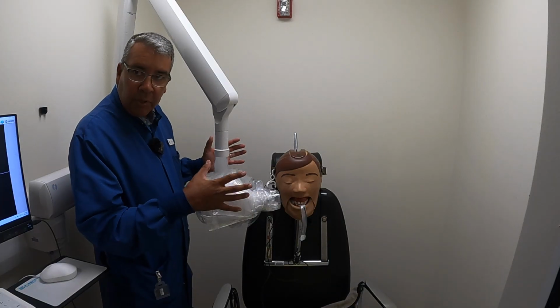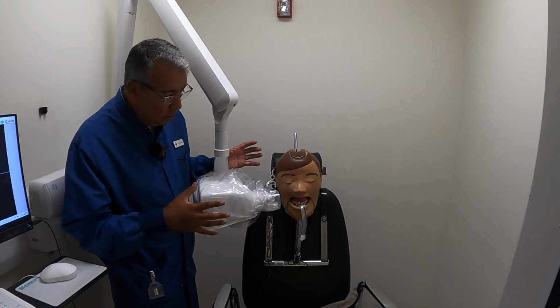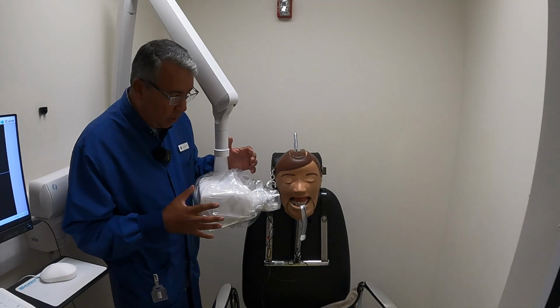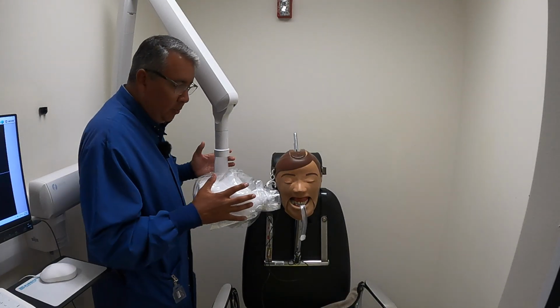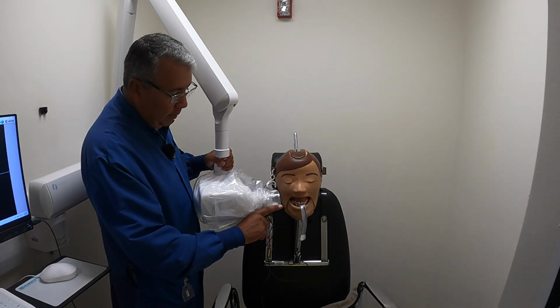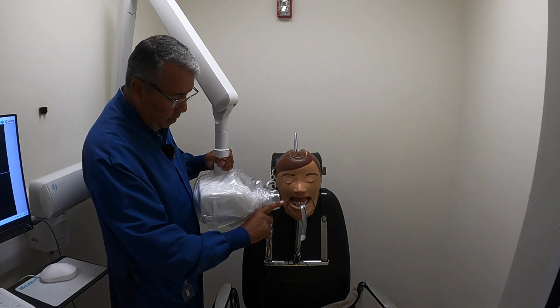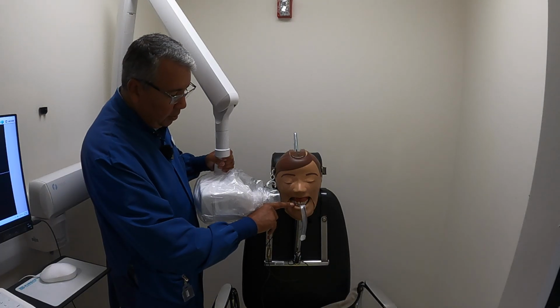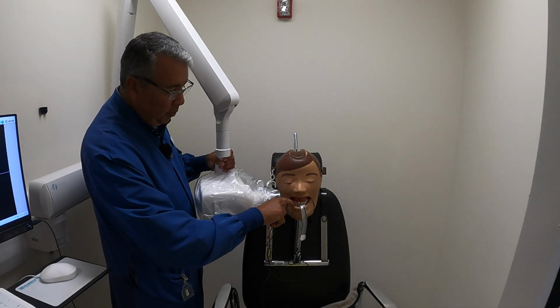You worked so hard for that horizontal angle, don't go, okay, right now all I can see are those premolars, I'm at the wrong horizontal angle, and then you move. Keep your horizontal straight, how you set it, and then the side of this is going to go right to your first premolar, which is right there.